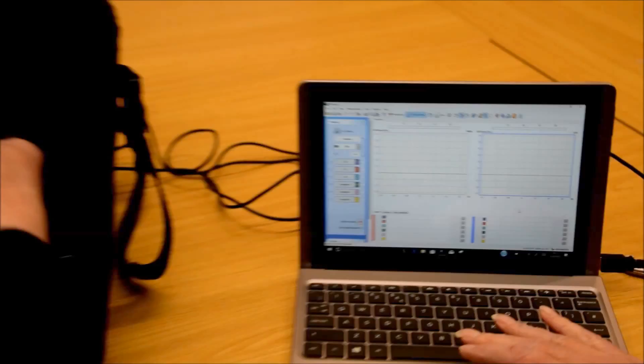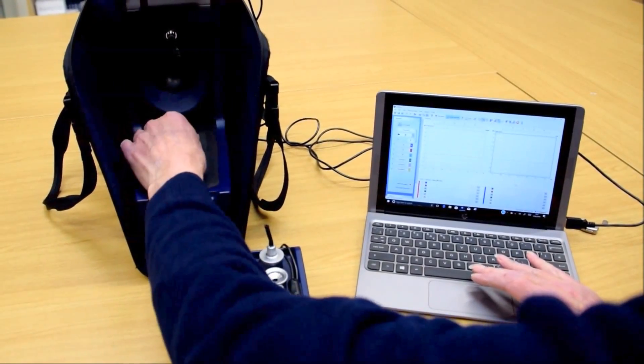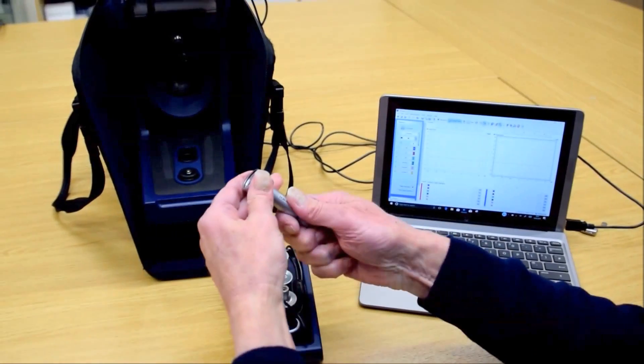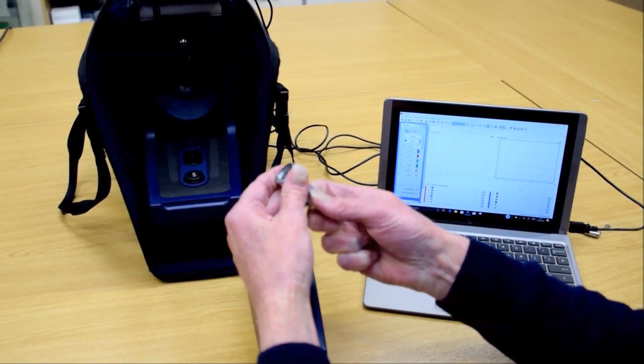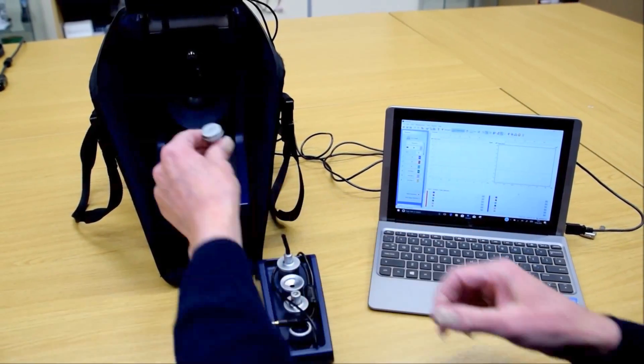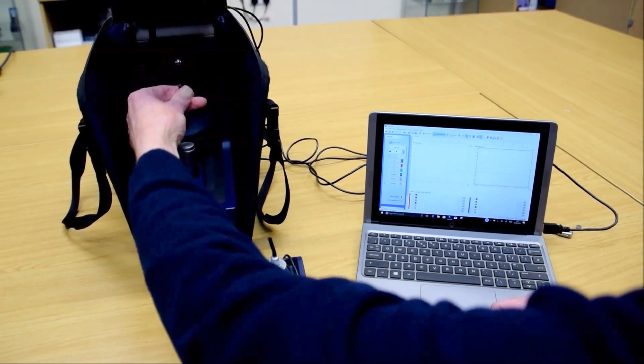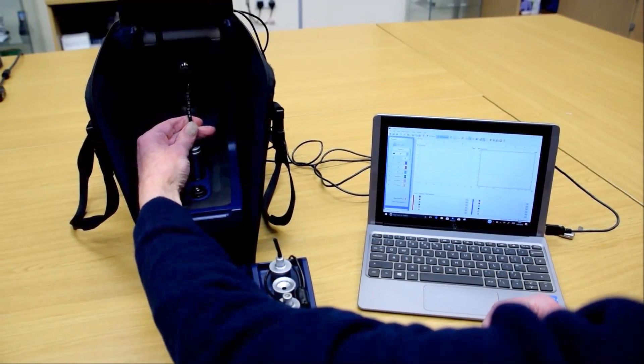Take the accessory tray out of the box, unscrew the 2cc coupler from the coupler microphone, and put the microphone in the center slot with the reference microphone directly above it.